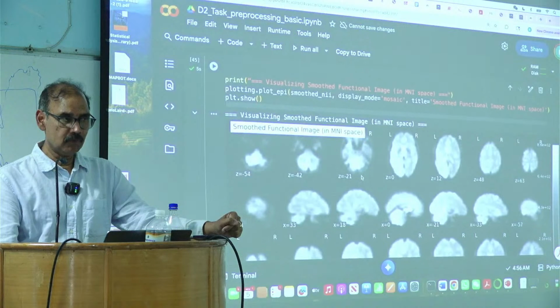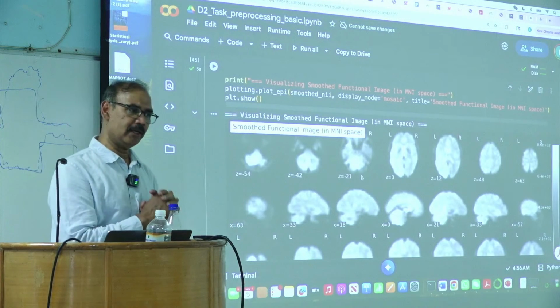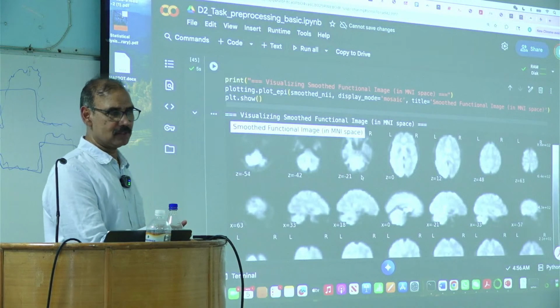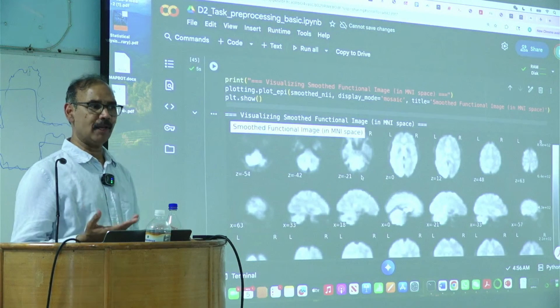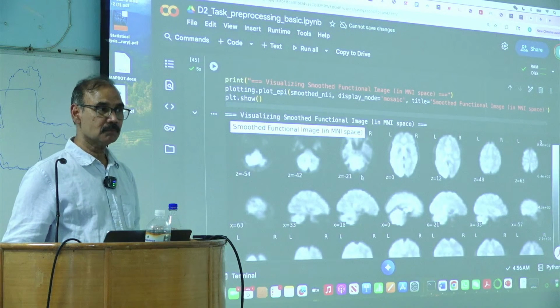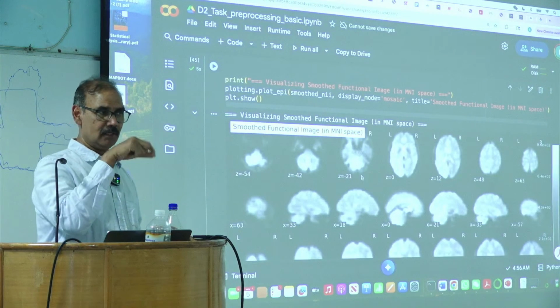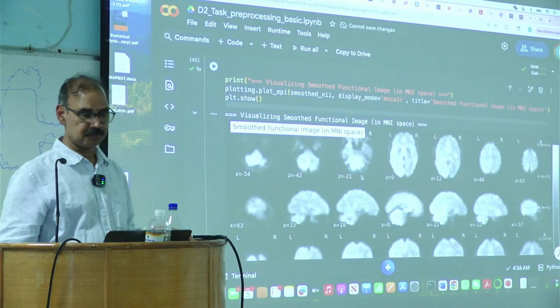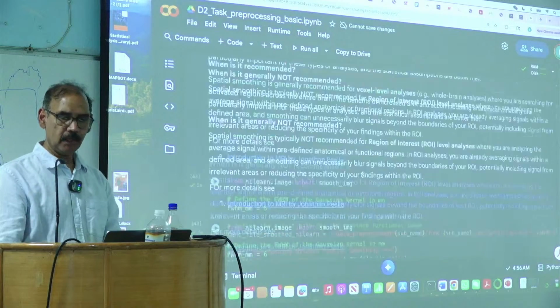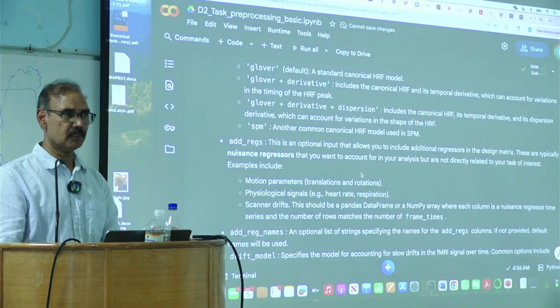But if you collect data at 2 millimeter by 2 millimeter, and then say I'm going to use a spatial smoothing of 2 millimeter, what does it mean? It's not doing anything, because you are smoothing just that voxel. All right. Okay, so everyone is clear with this?